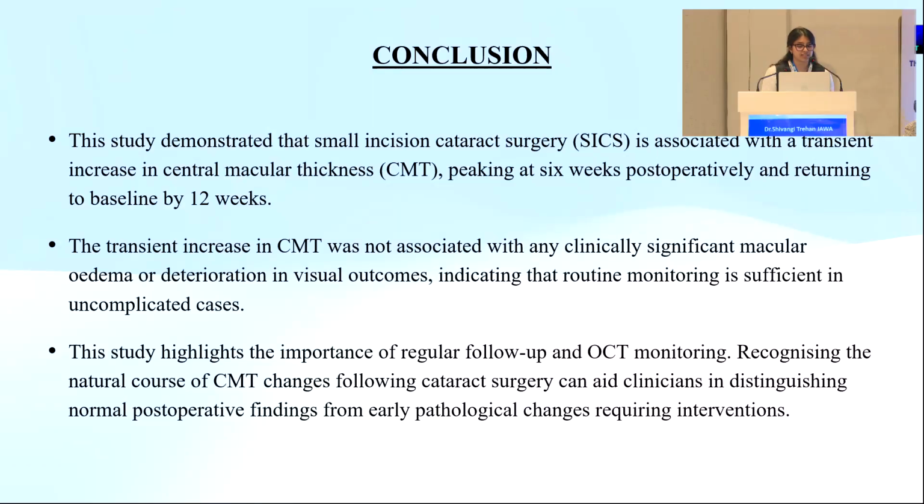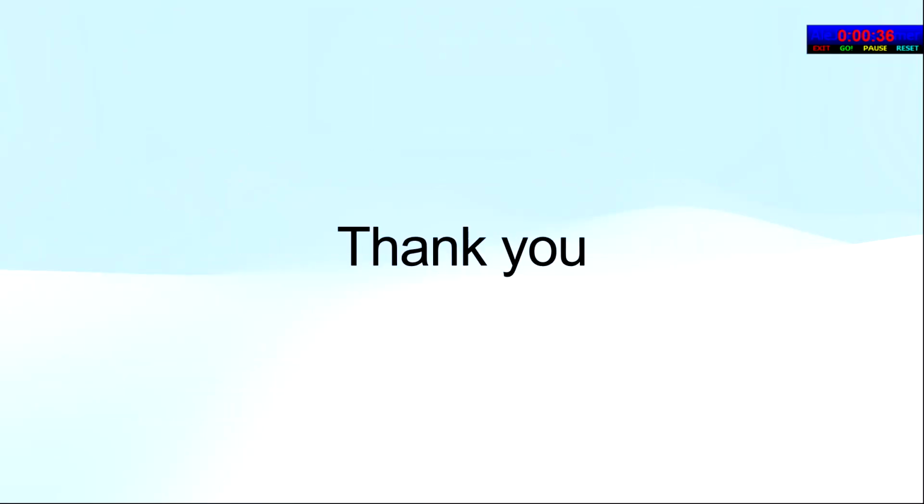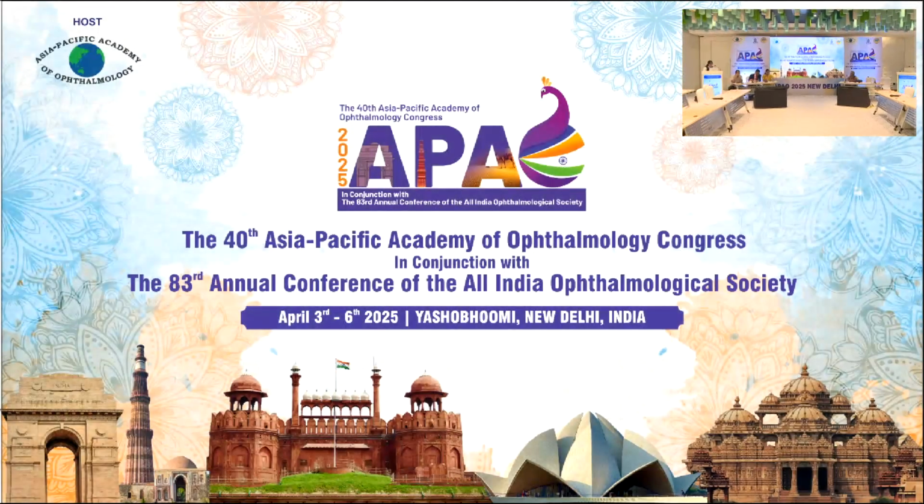The transient increase in CMT was not associated with any clinically significant macular edema or deterioration in visual outcomes, which indicates that routine monitoring is sufficient in uncomplicated cases. The study also highlights the importance of regular follow-up and OCT monitoring, recognizing the natural course of CMT changes following cataract surgery, which can aid clinicians in distinguishing normal post-operative findings from early pathological changes which require intervention. Thank you.